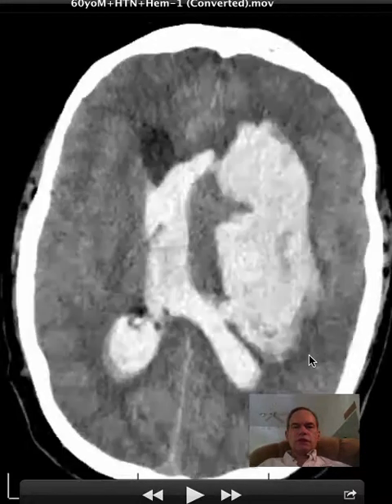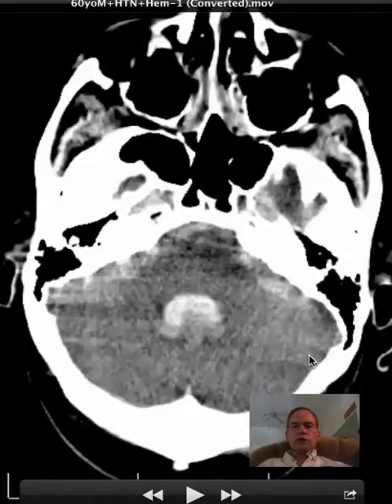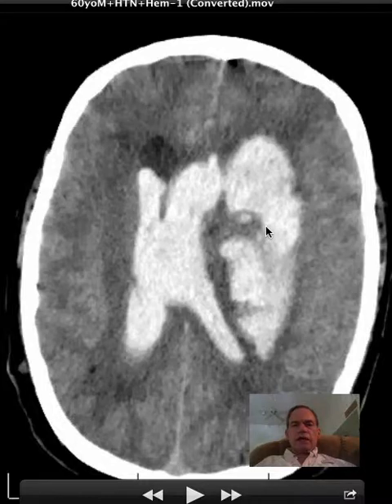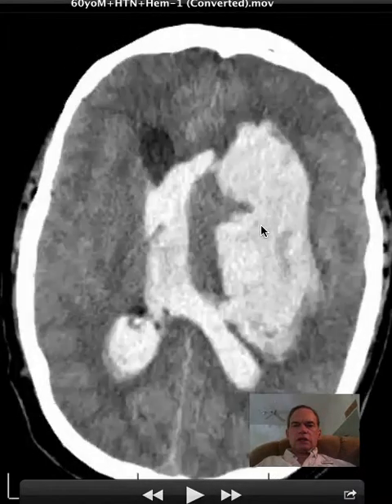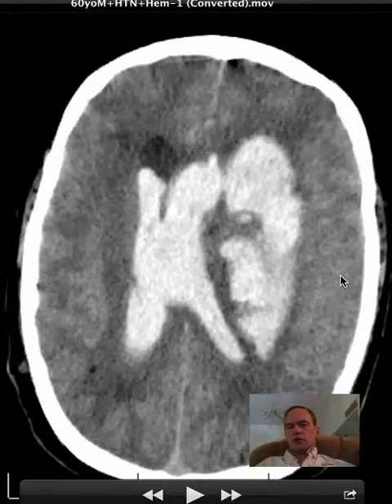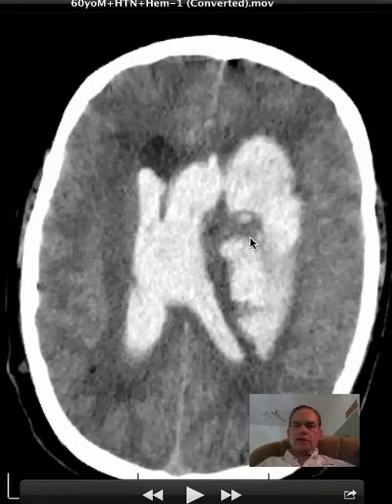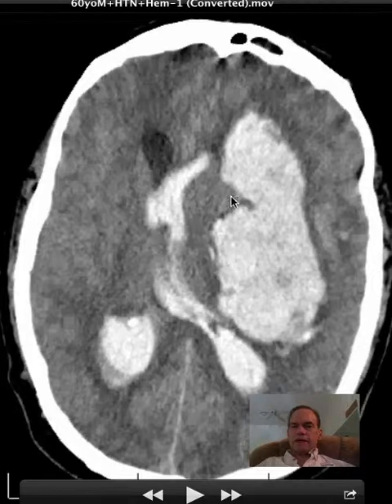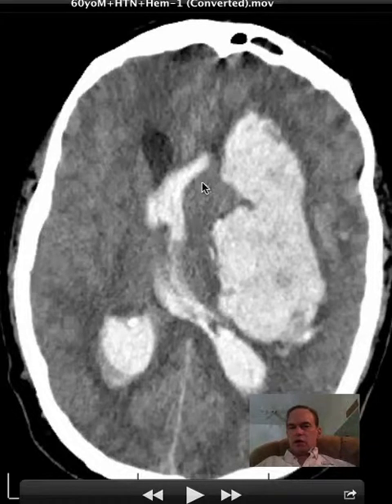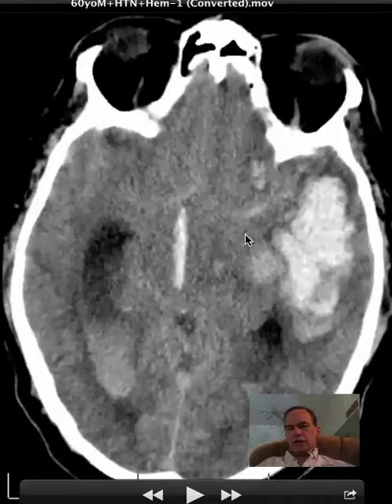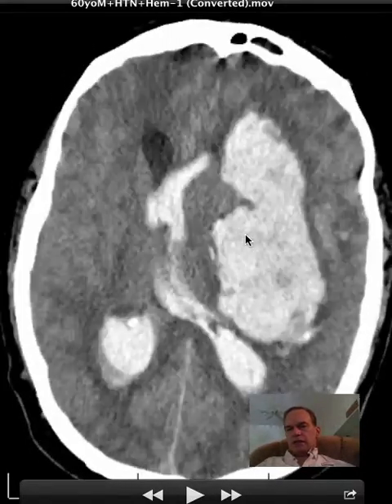Hello there, this is Dr. Mintz. This is a head CT in a patient with an intracranial hemorrhage — that should be quite obvious. We have hemorrhage in the left cerebral hemisphere and we have it in the ventricle. Which do you suppose took place first? This left hemispheric area of hemorrhage involves portions of the basal ganglia; the caudate nucleus head would be here, putamen is here, and globus pallidus is back in here. So this could be a globus pallidus hemorrhage, and I would suspect that's the case.